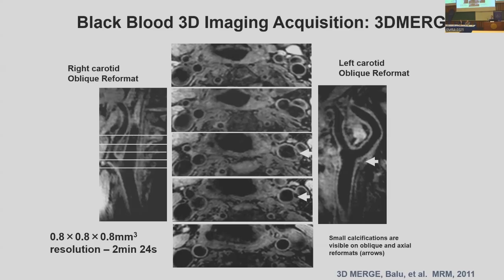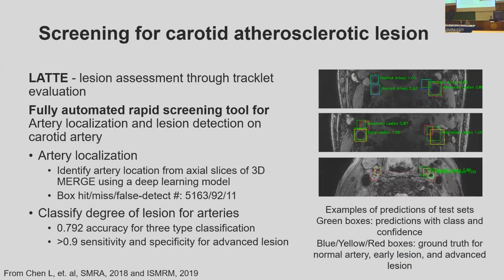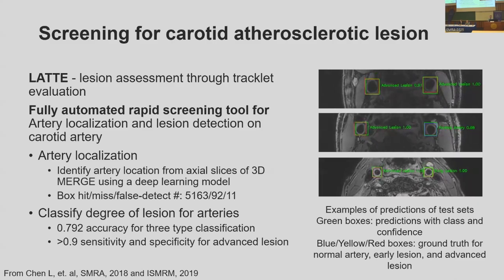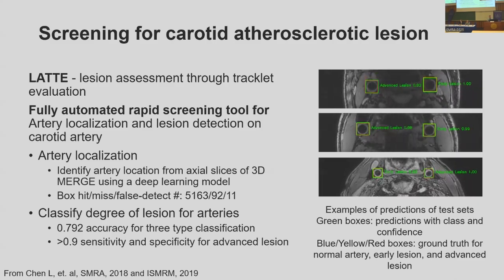But if you have images like this and want to process them in 3D with so many slices, and you need a human to identify the lumen and outer boundaries and then measure so-called thickness and other things, this becomes a total nightmare because it takes too long. So we have been trying to come up with a good way to process the data.